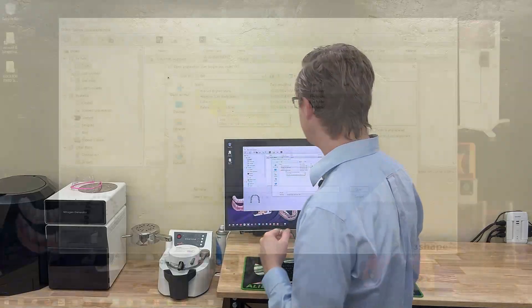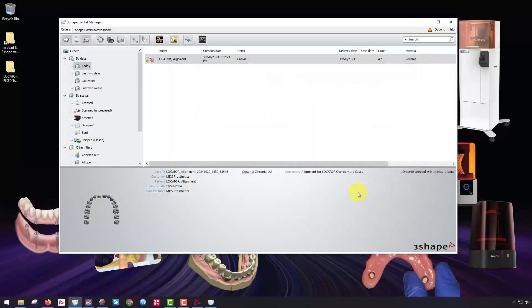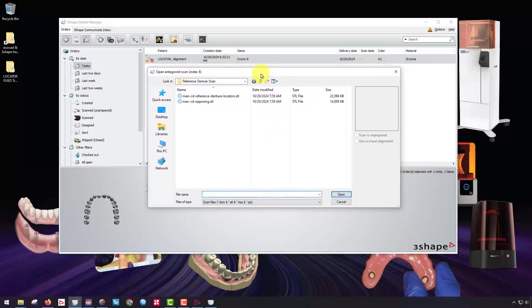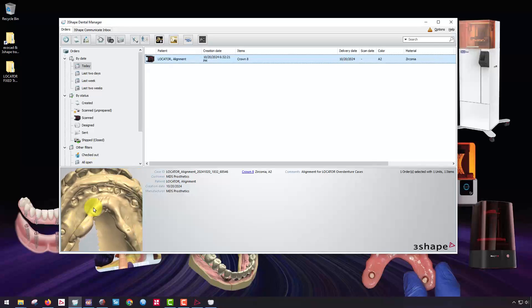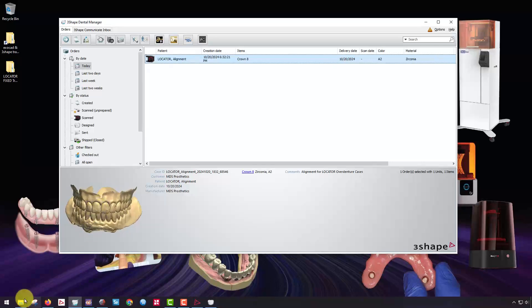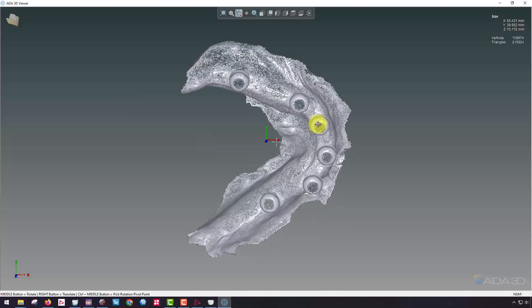Then I'm going to align that intraoral scan of the scan bodies to the reference denture scan. I'm going to open up my reference denture scan folder — it's going to ask me for the upper jaw. I'll open up my max CD opposing, which is the patient's upper denture. I'm going to open up the antagonist, which is going to be the reference denture shown right in here, and click open. So we're simulating a mandibular arch — upper CD with a lower CD with relined locator abutments — and I want to align the intraoral scan that's refined.